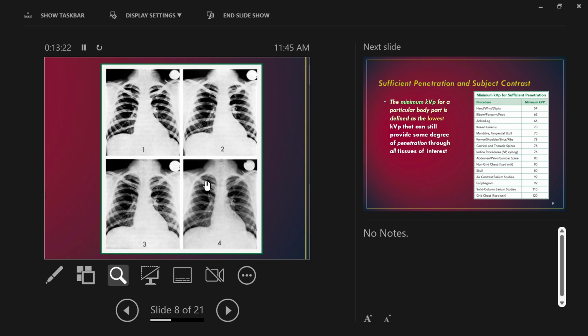So instead of just black lung and white everything else, I get a lung field that shows me lung markings. I see a difference in density and brightness from the top of the lung field to the bottom. And now I can start to make out that there's structure, something behind the heart, where I definitely can't in at least the first three of these, okay? Harder to see, but now I can start to make out there's an air-filled trachea here.